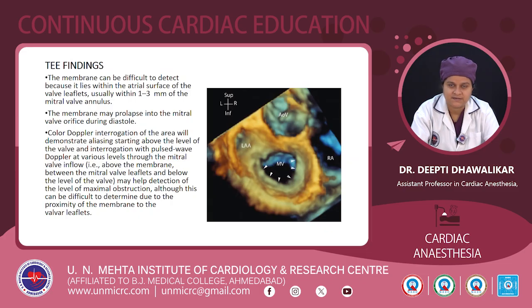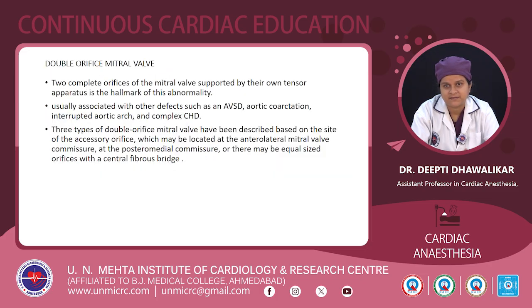So this is a 3D TEE view of the mitral valve en face seen from the atrial side. So you can see the mitral valve down, which is seen in blue hue, and on top is the supramitral membrane, which is represented by arrows.